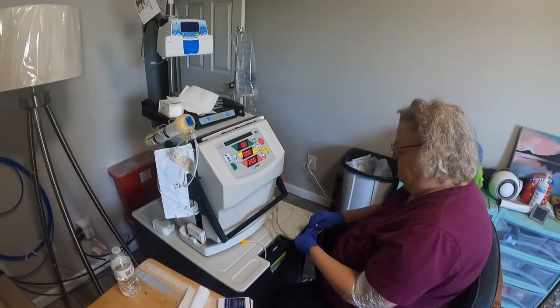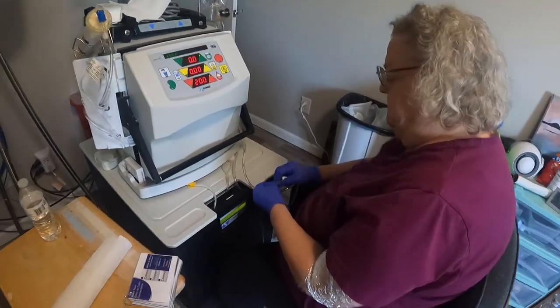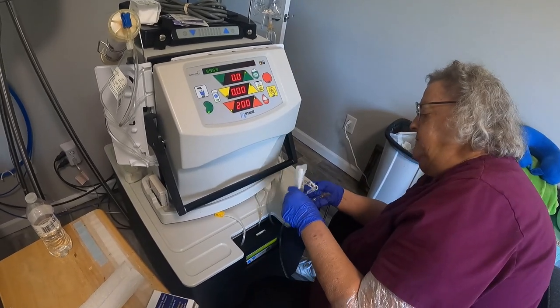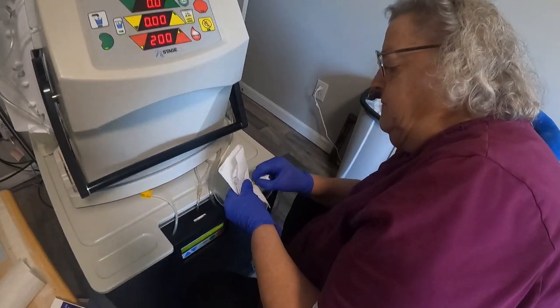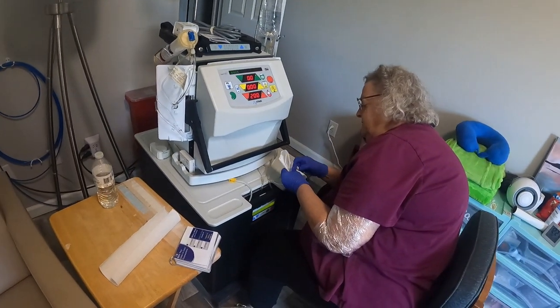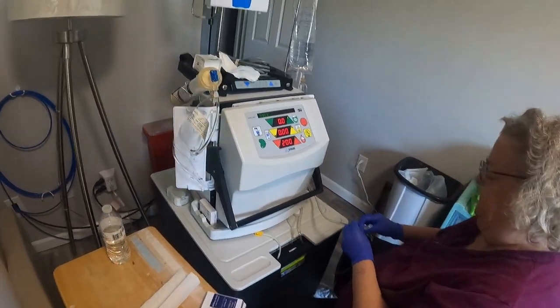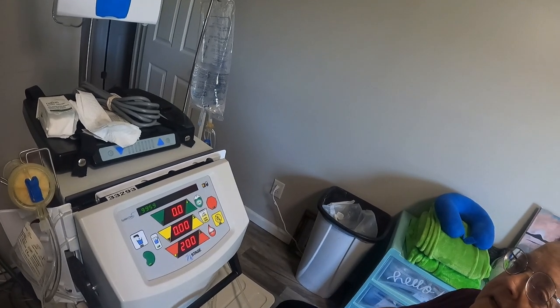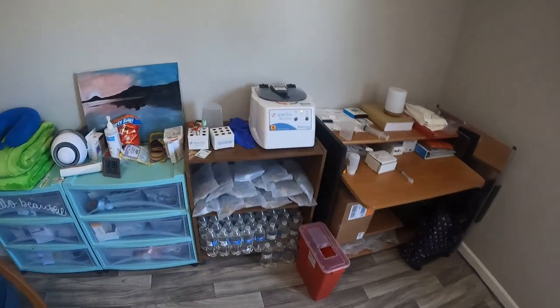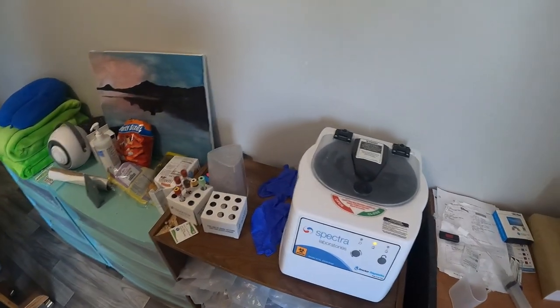So dialysis is basically when your kidneys fail to filter out the body stuff. I didn't get all the air out. Get the air out. See, it's all technical. But after doing it, now, I watch the professional here. Does he have to just turn this on with the clicker? Yeah. So when they get going, I will definitely wear gloves just to be part of the cleanliness. But we'll bring it back when we get some time.